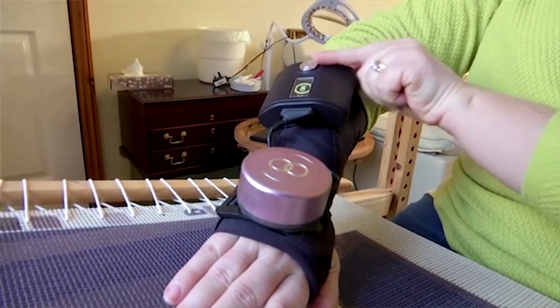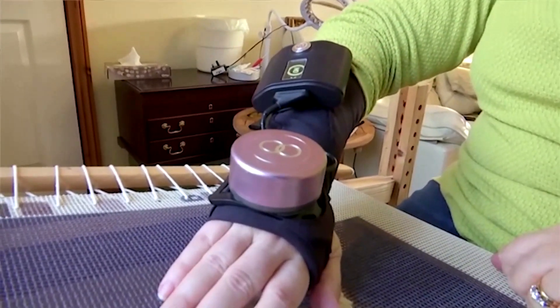It just frees you up. You can enjoy your hobbies more, you can work more effectively at typing. The gyro glove is huge because there is not a lot out there to help us.